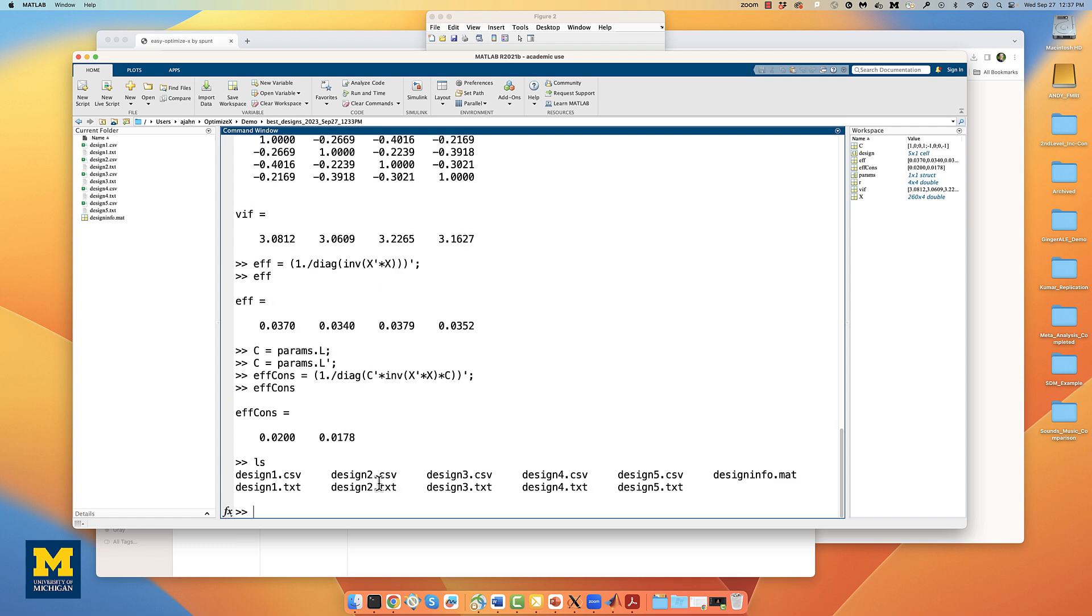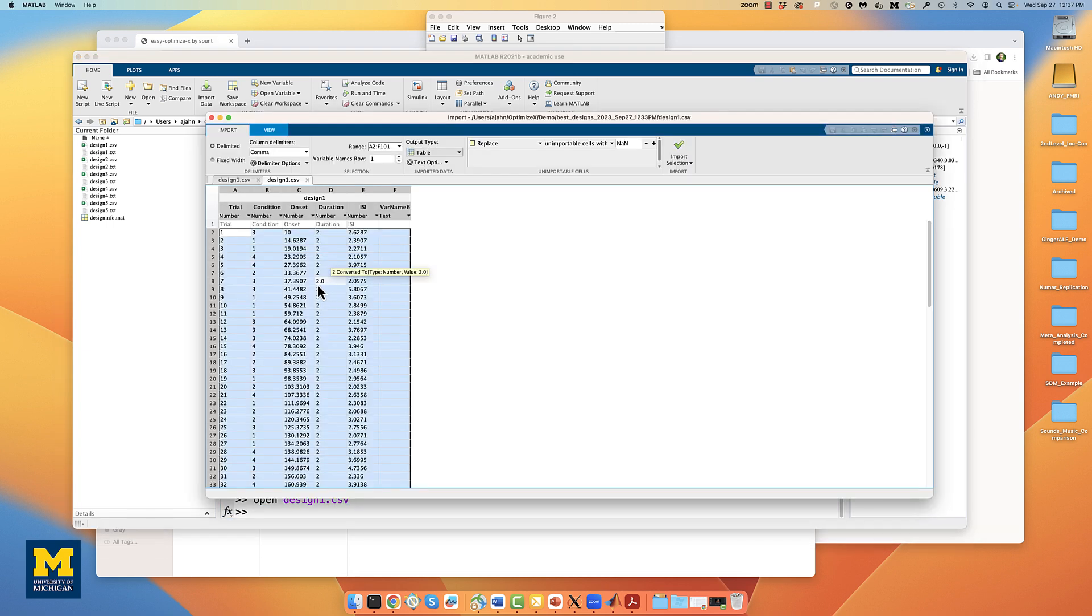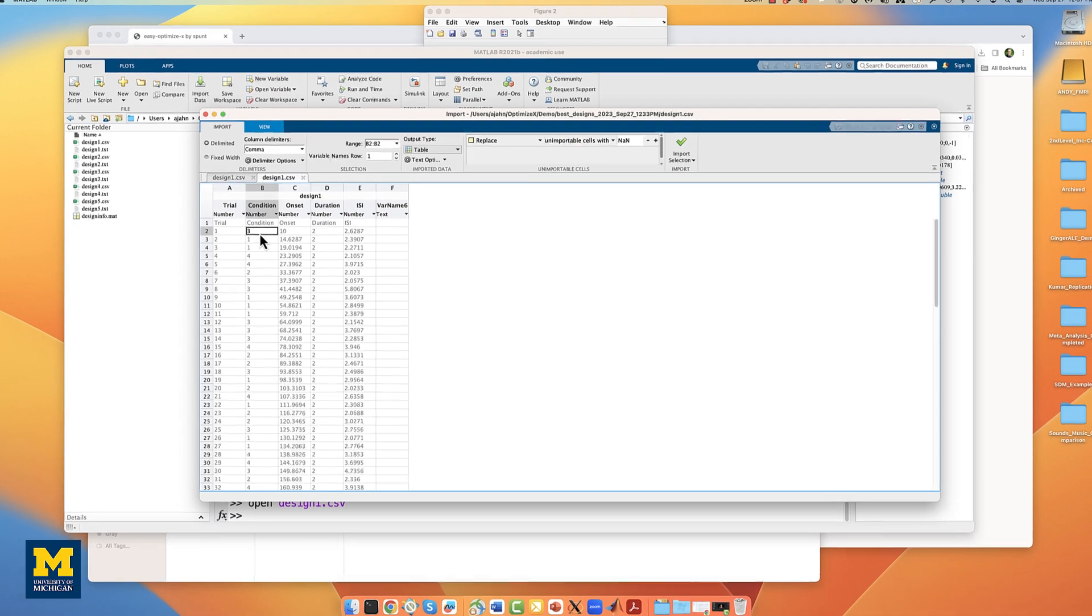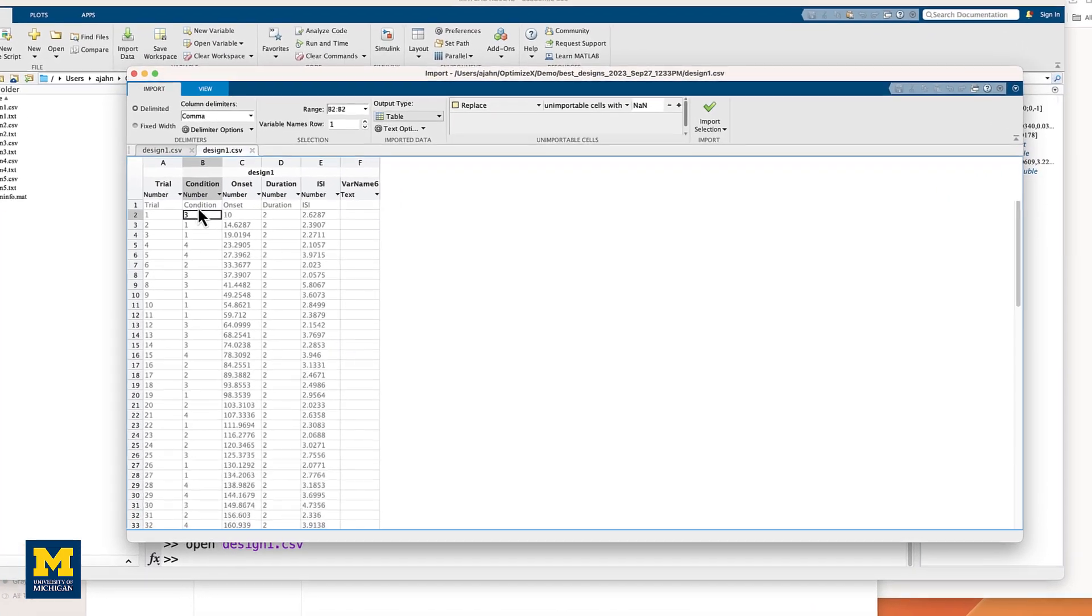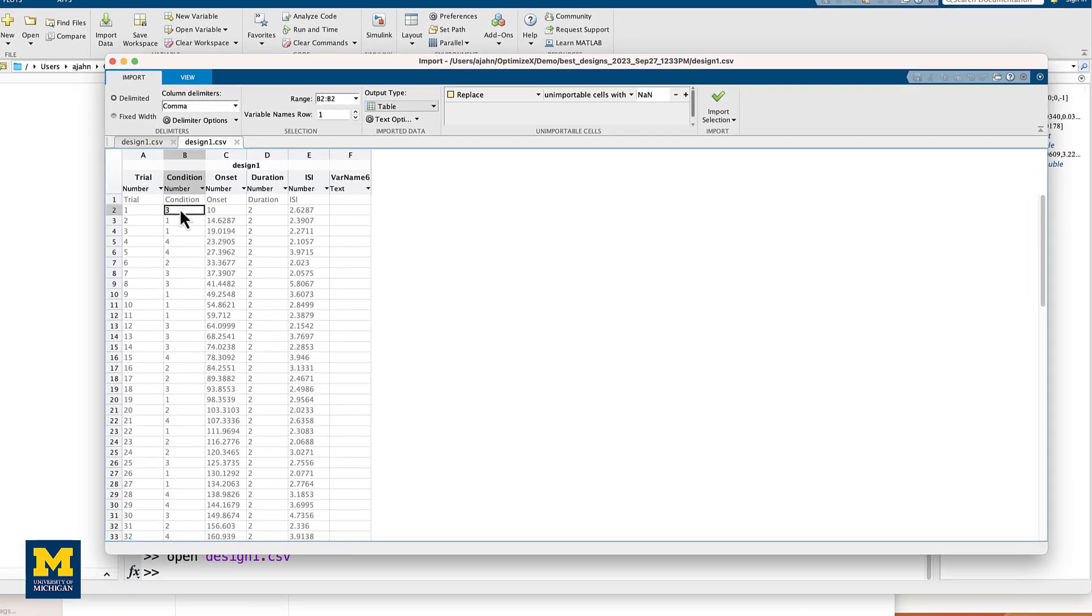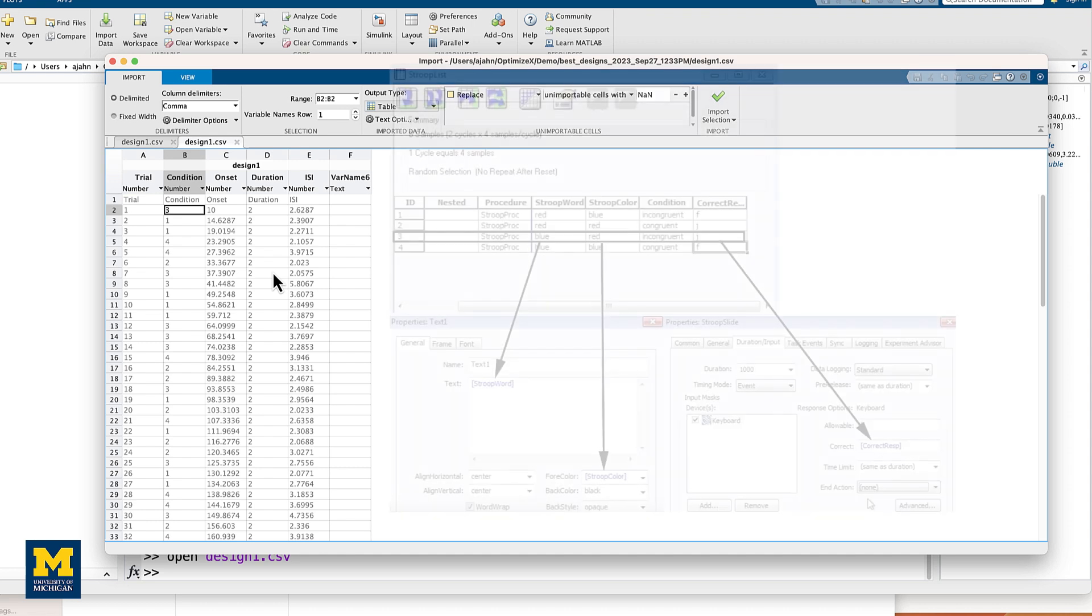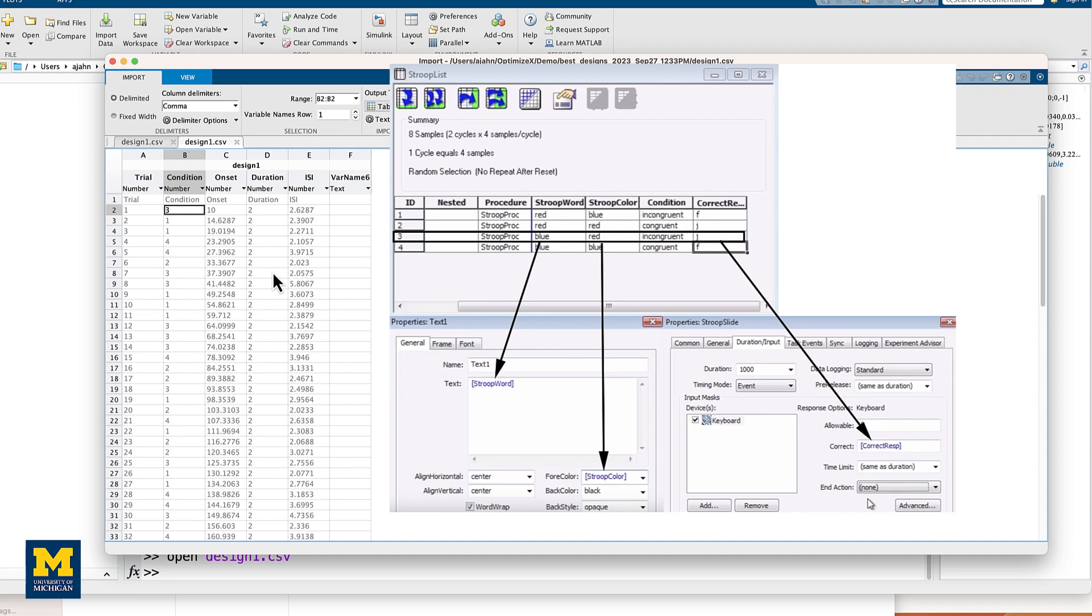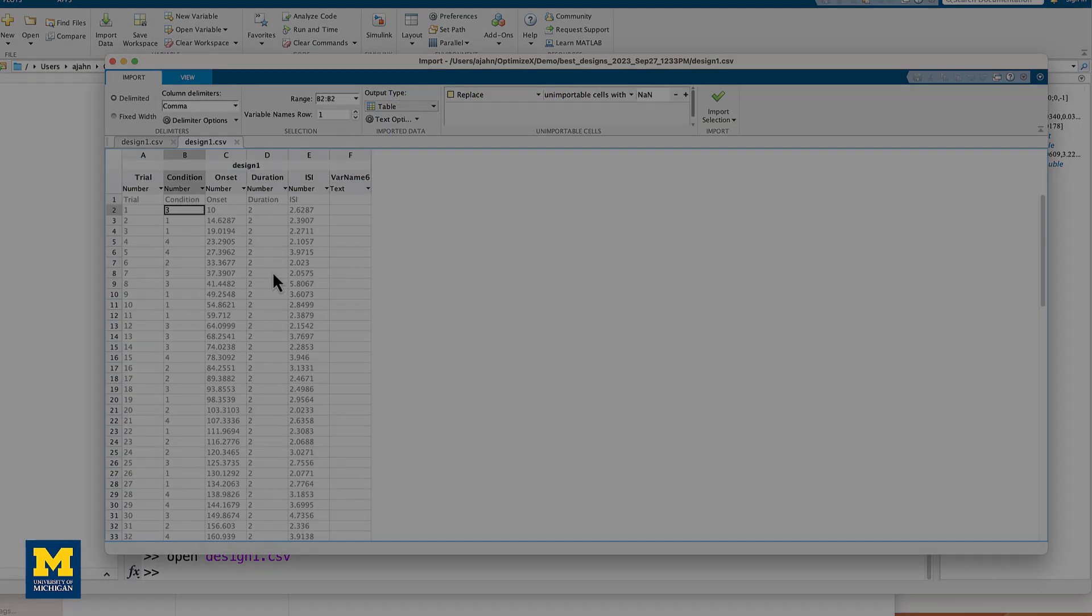So which design should we use? If we look at all the possible designs and we open the first one, called the best one by optimizeX, we see the timing schedule already written for us. All you need to do is replace these condition numbers with the actual conditions in your experiment and then import these onset times into the presentation software of your choice, such as E-prime.